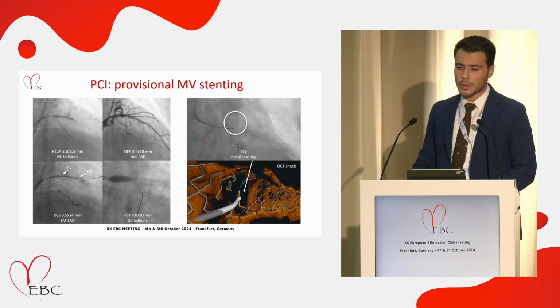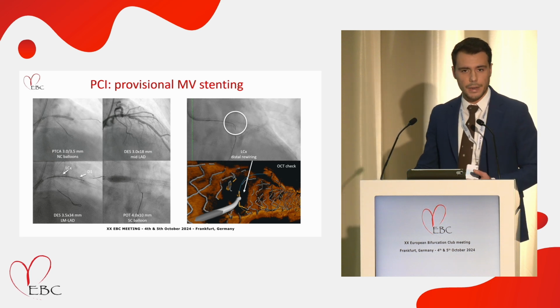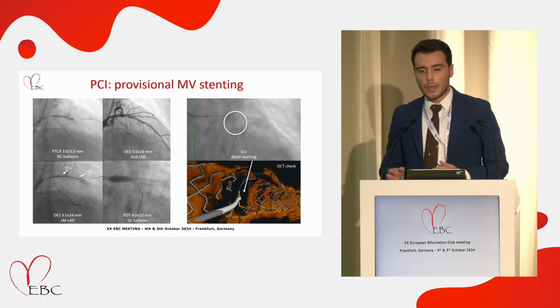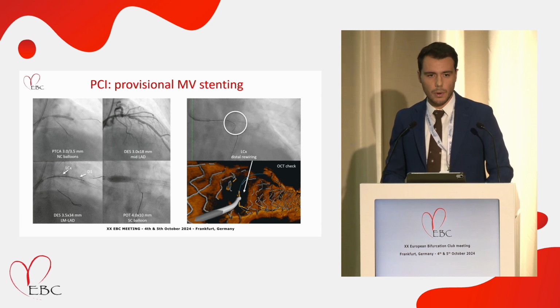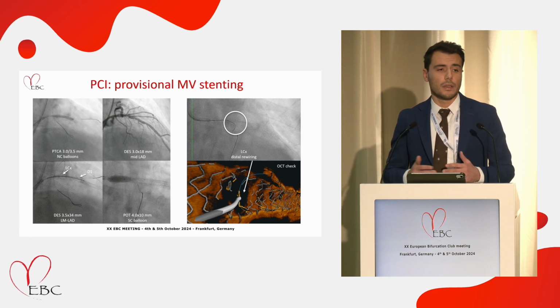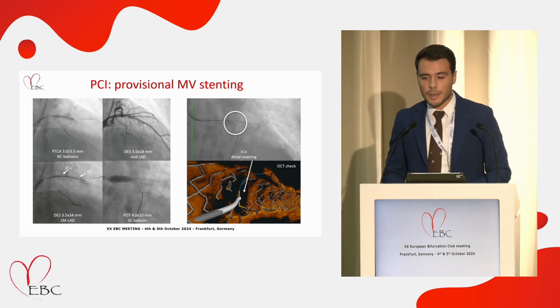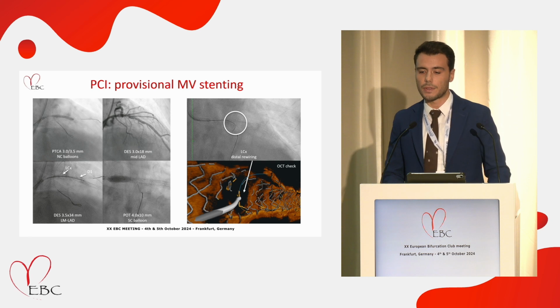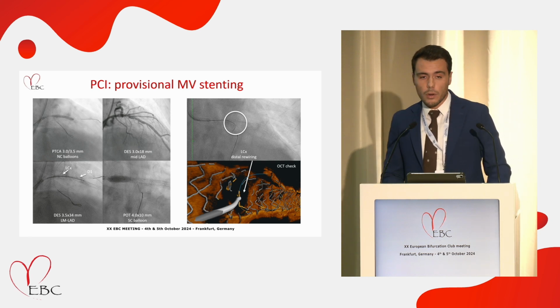And then a very important step that I want to focus on a little bit is the distal rewiring, because either using the pot-side-pot or the kissing balloon, this is a key step of the procedure to get, of course, the best achievable result. You can check that both through the angiogram, using markers such as the previous wire, the jail wire, or also imaging.